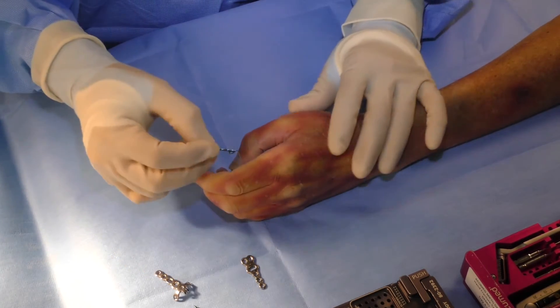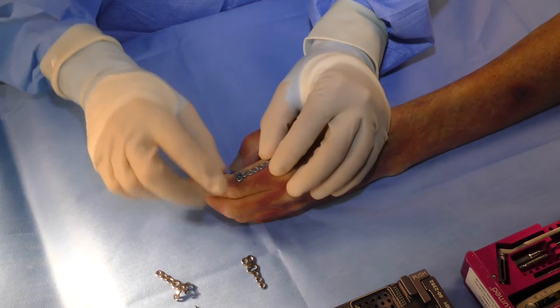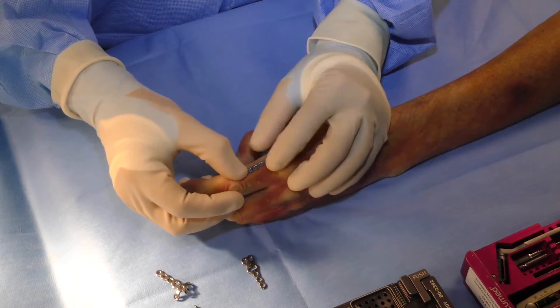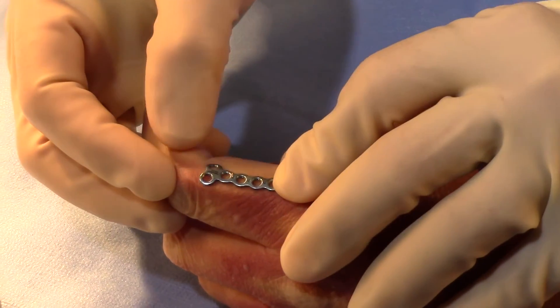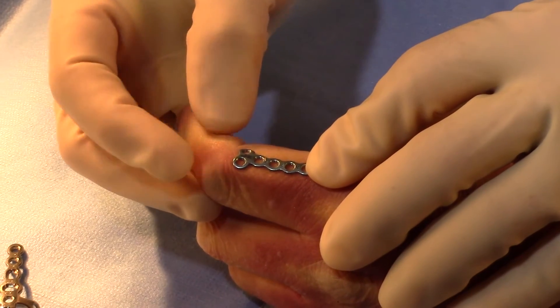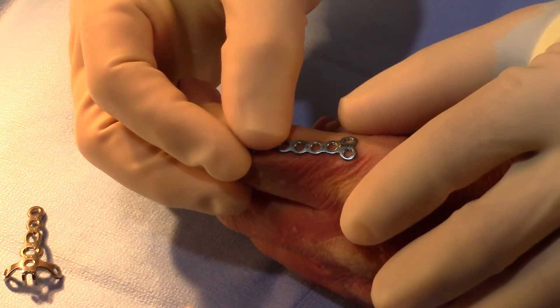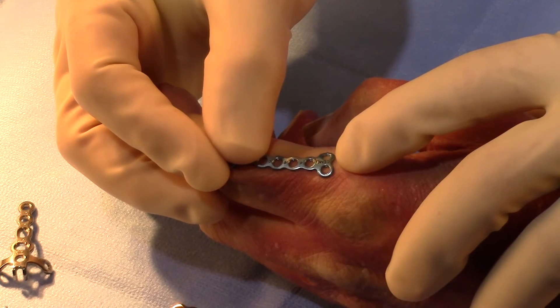The curved phalangeal plate is unique in that it has a curve in the coronal plane, so it can be applied on the lateral aspect of a phalangeal fracture. If there is a distal fracture, the plate can be cut short and locking screws used to engage the distal condyle of the phalanx. If the fracture is at the base, the plate can be cut distally and the T portion used to stabilize the base of the phalanx fracture.